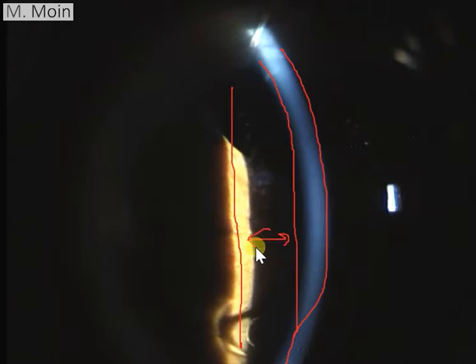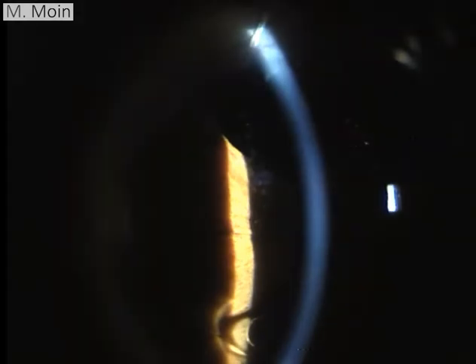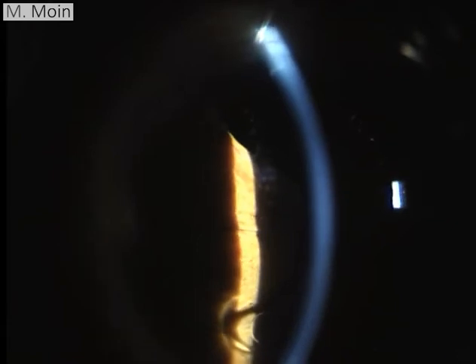So you want to see if any part of the IOL is touching the endothelium or not. Usually when you're lying down or in a prone position, that IOL, which is a displaced IOL, will be mobile and it will be rubbing against the endothelium. It is also going to rub on the iris as well. So most probably this patient will have low-grade anterior uveitis. They can also get hyphemas, which are part of the UGH syndrome.